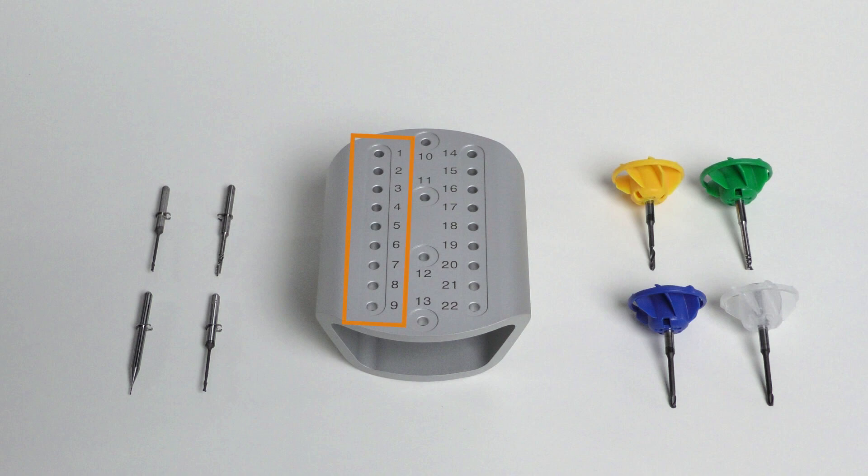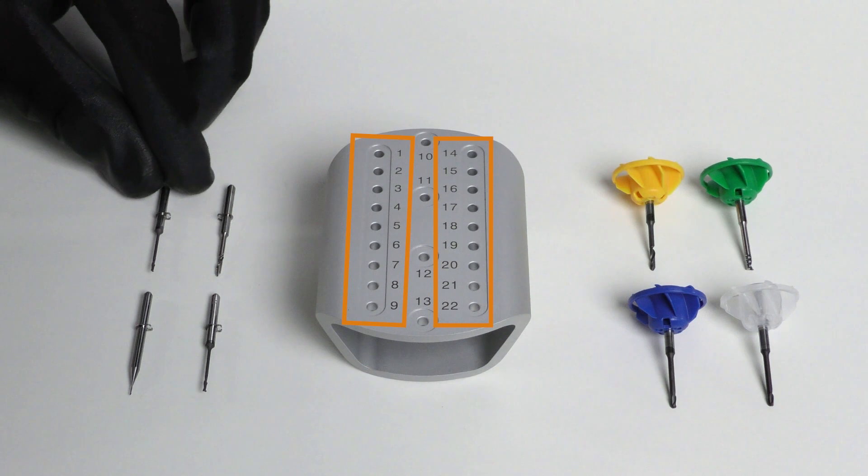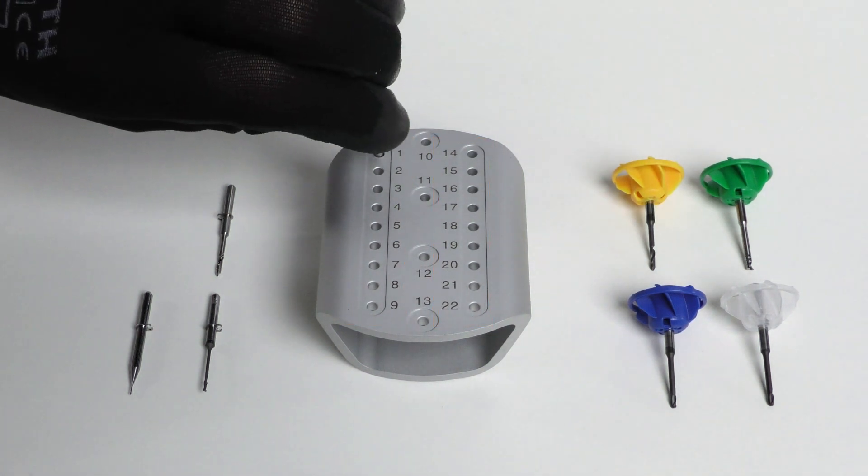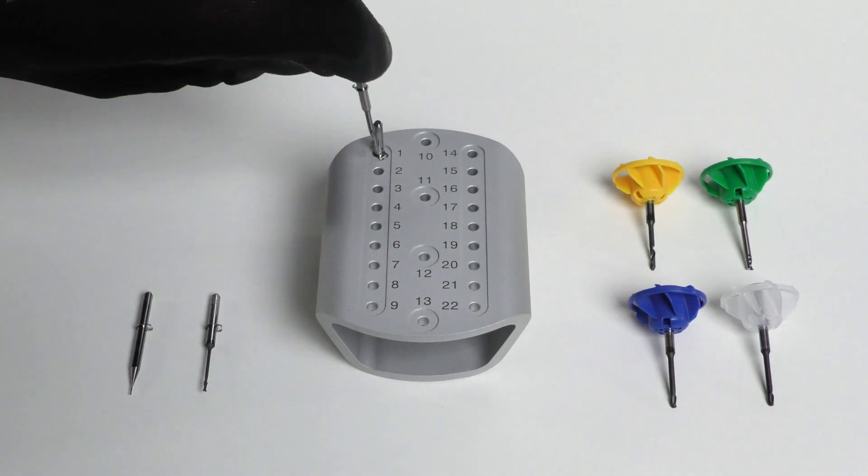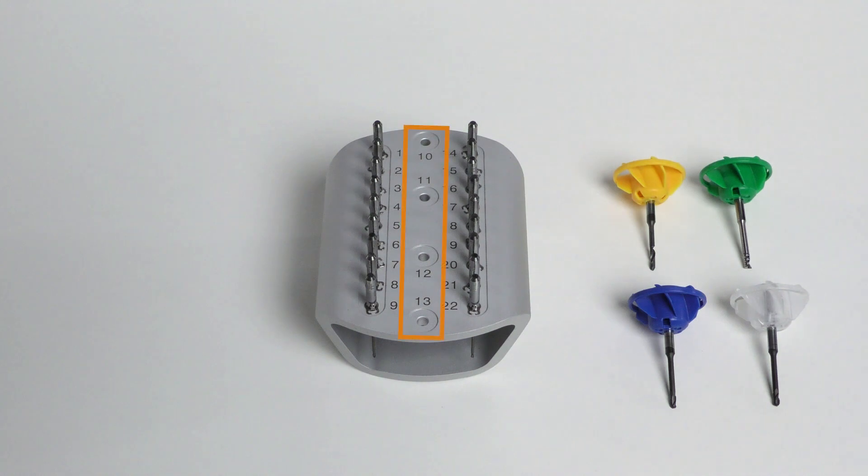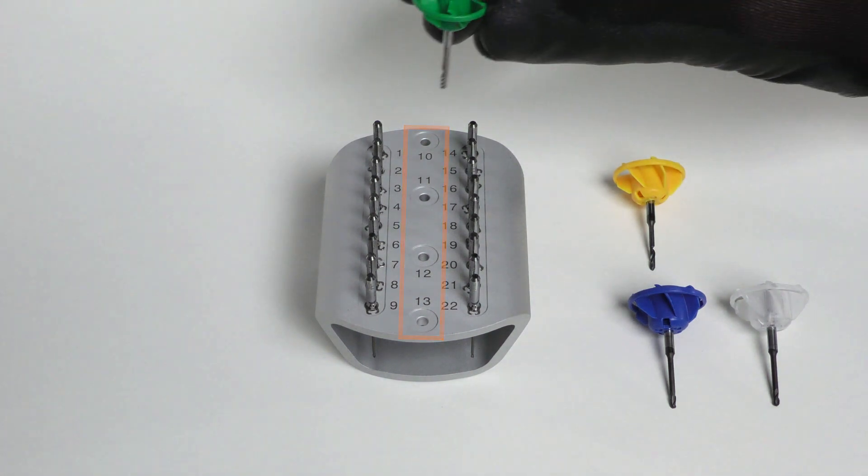Positions 1-9 and 14-22 can be used for conventional dental tools with stop rings which are suitable for your machine. Positions 10-13 are suitable for one air tool each.